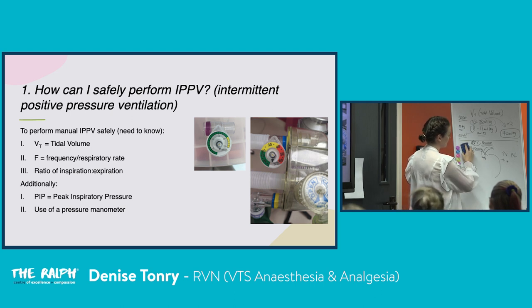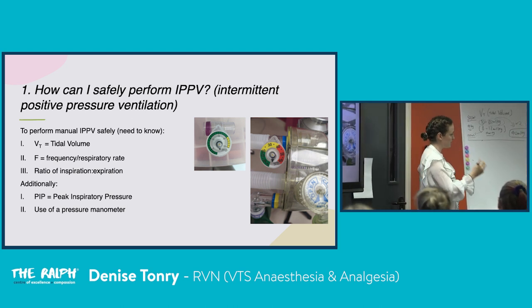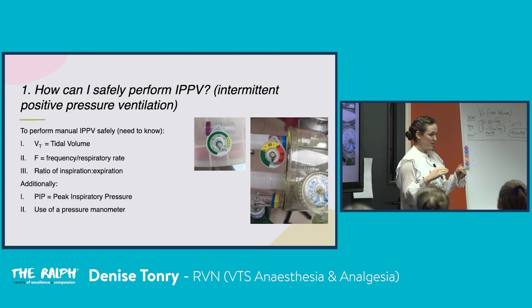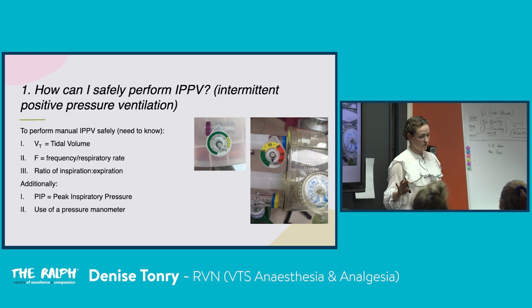All of this physiology applies to mechanical ventilation. This is what we're using when we're mechanically ventilating them as well. So all that manual IPPV can be brought through to mechanical. So when we do frequency, usually a natural ratio is your inspiratory time, let's say for argument's sake is 1 second, expiratory time is 2 seconds. Usually an inspiratory to expiratory ratio is 1 second to 2 seconds. So you breathe in 1 second, out 2 seconds.